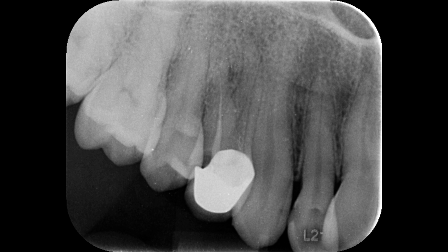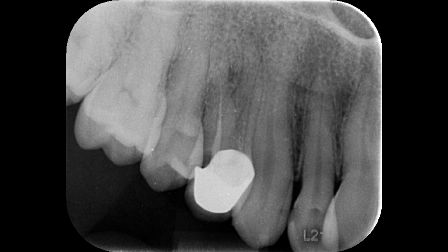After that I started my root canal treatment. I shaped both canals, prepared them with a taper, and obturated both canals to the full working length. This is the post-operative radiograph — you can see the difference. Both canals are very well prepared and obturated: this is the buccal canal and this is the palatal canal, both filled to the full working length. This is the temporary glass ionomer cement.